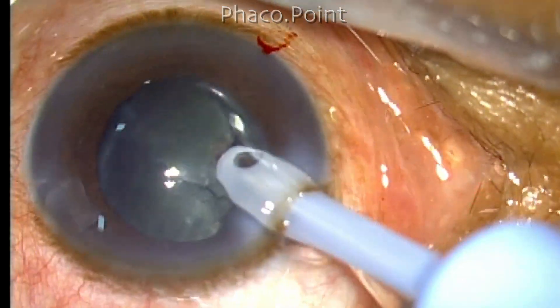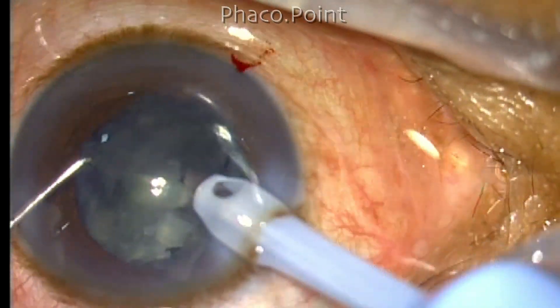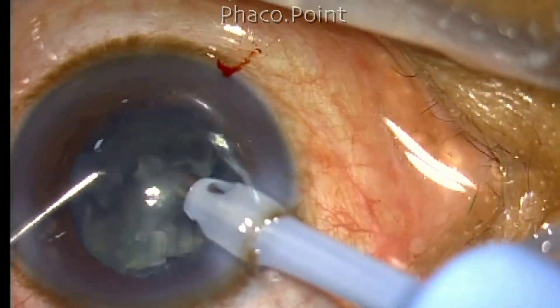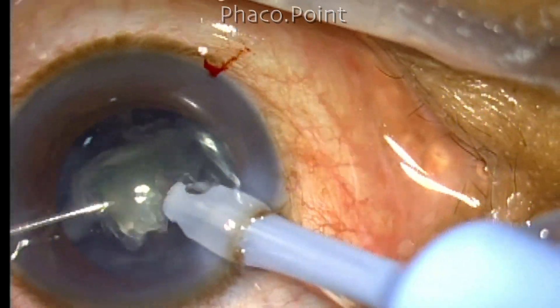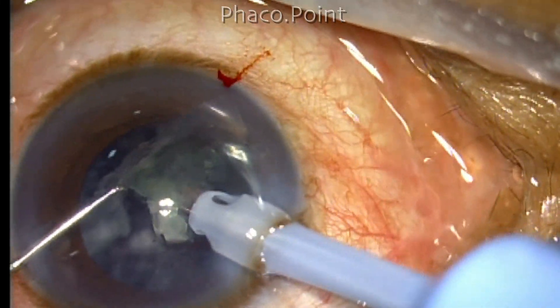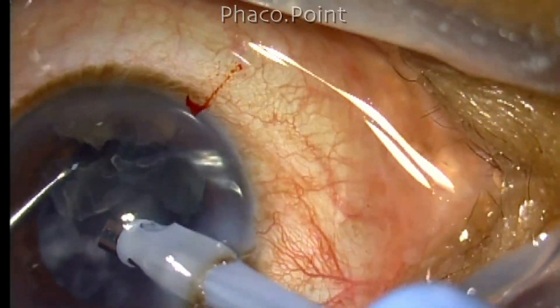When you set an aspiration flow rate of about 40 cc per minute, this high flow rate will cause hydrodissection to happen. Once the nucleus rotates, the management of this cataract is not very difficult — it is a grade 2 nucleus sclerotic cataract.